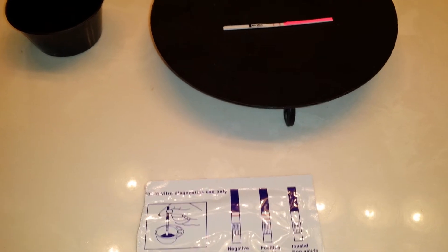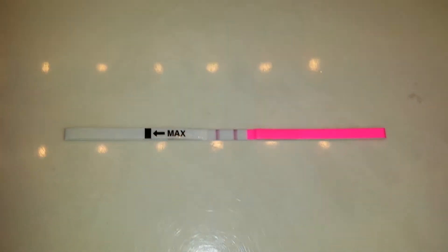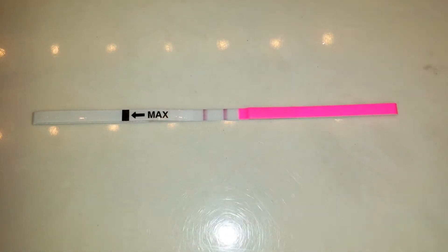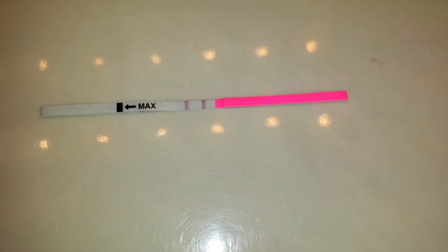It's been about six minutes — okay, there we go. As you can see, it is positive. That is very positive. So that means one of two things: last night's test was a fluke. Maybe my urine was a little too diluted — it did look lighter even though I held it for about three hours, and I did it very late, so that may have had something to do with it.